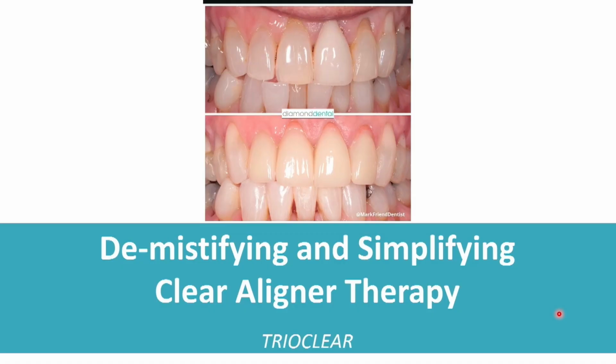One of the really nice things about clear aligner therapy, which I've discovered as a dentist, is that it fits so well if you've got an interest in restoring teeth, particularly front teeth. It fits really well, and the example of the case we can see in front of us is a really good example. This lady had a single veneer placed on the upper left incisor, and it had served her very well, and I think they'd done a good job.